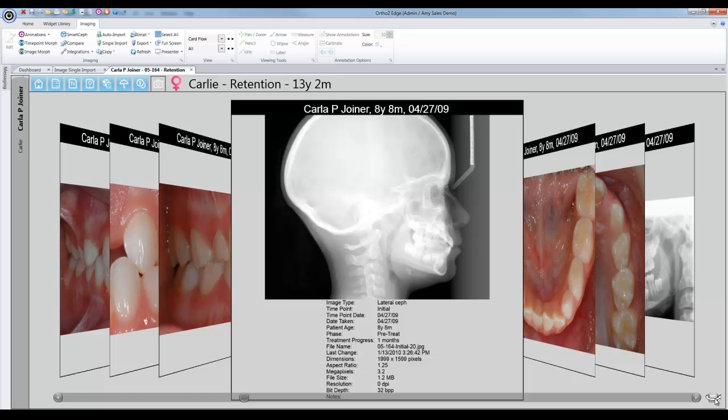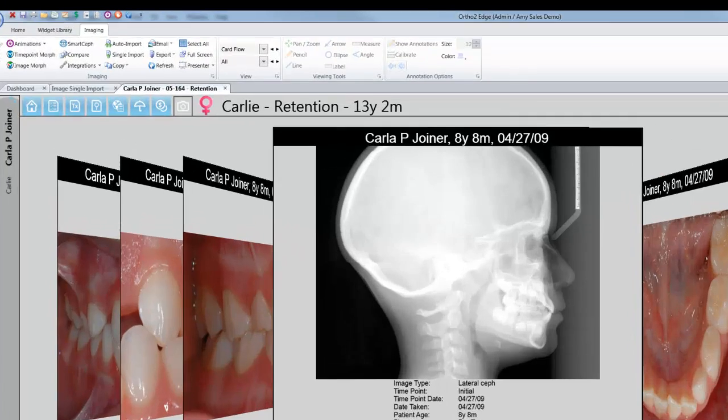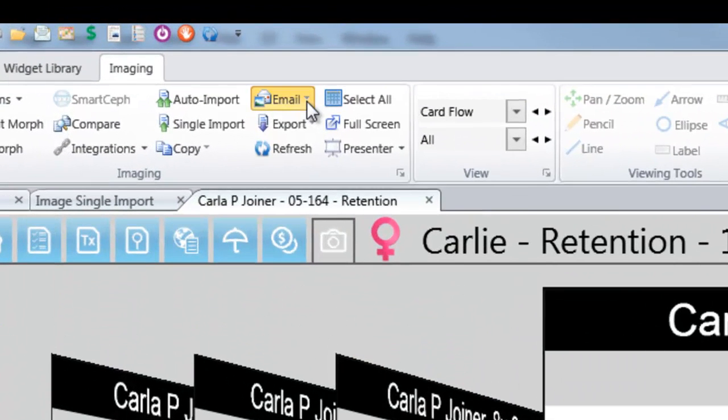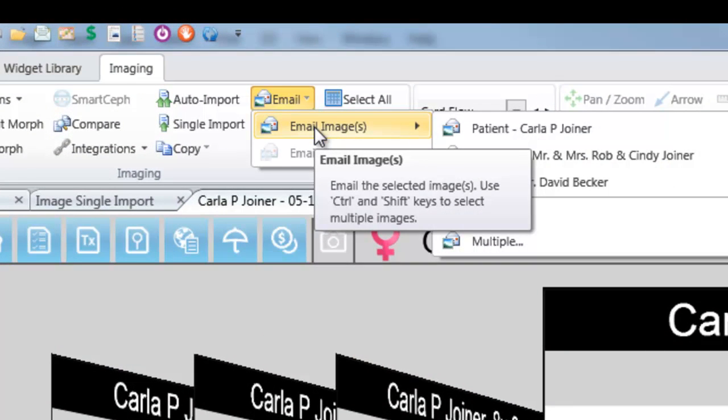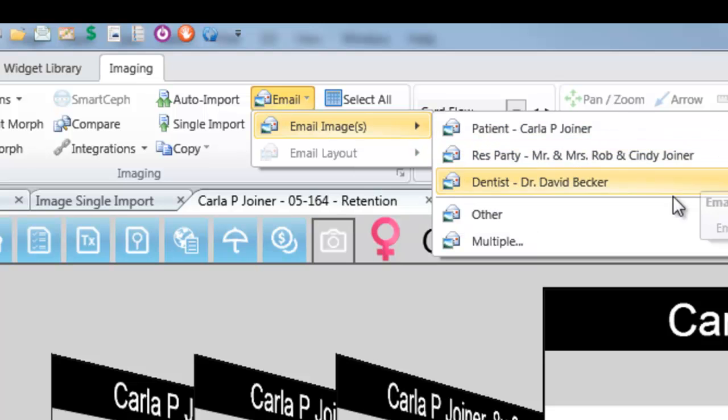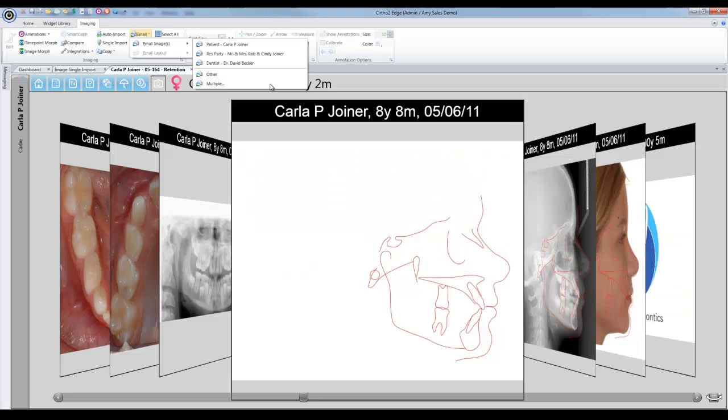Also note that you can easily email an image or image layout to a patient, responsible party, or dentist, or even multiple individuals at the same time.